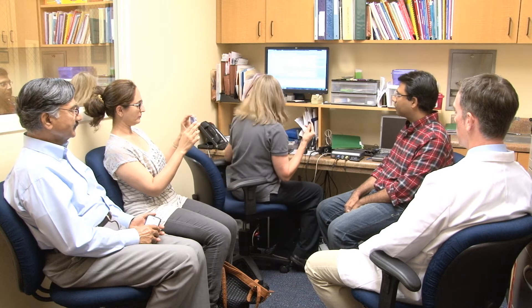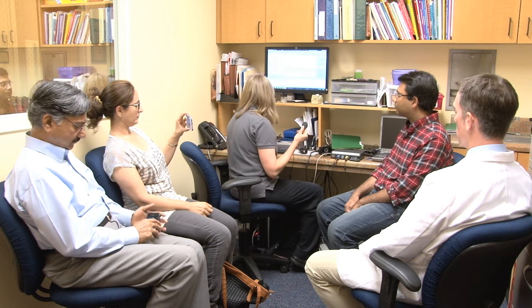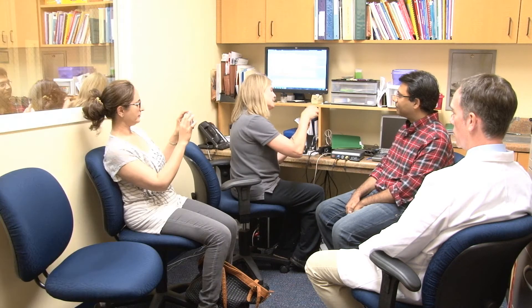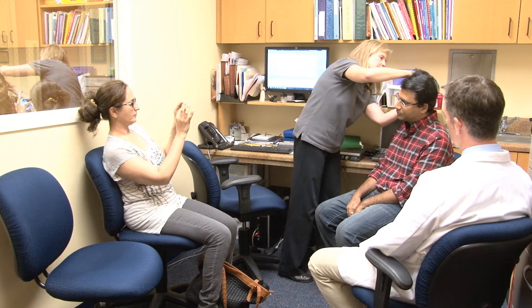I'm going to go ahead and use your RONDO speech processor. That's the all-in-one processor, which you may find that you wear more than the other one. You're going to get two types of processors today — this RONDO, and then you also get one that looks behind the ear. But this is the RONDO connected to my computer, so we're going to try this one first.